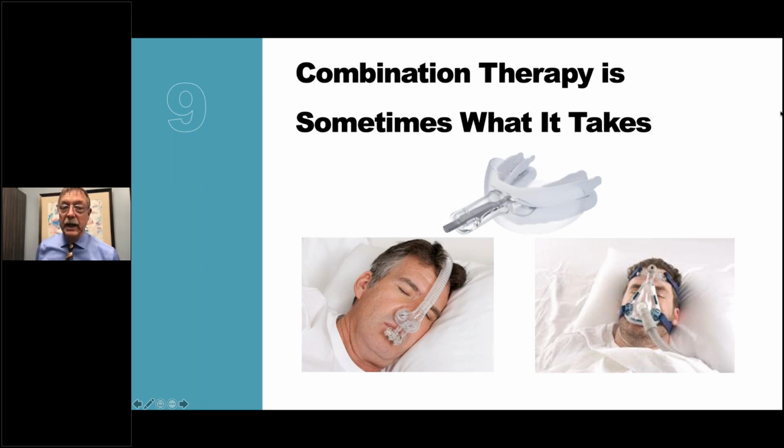So with a MyTap, you can help them with a mandibular advancement position because it's an in-office precision-made customized device. And then they can move their jaw forward, but then you can add the silicone cover and make sure they're a nose breather, and you get to test many different vectors for therapy all at one time.